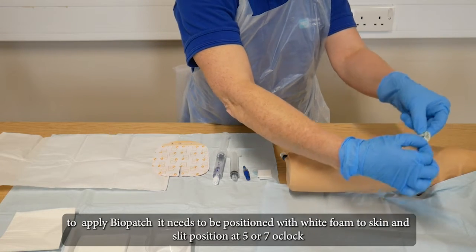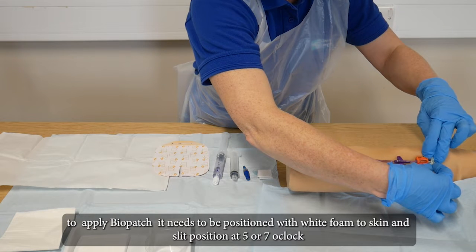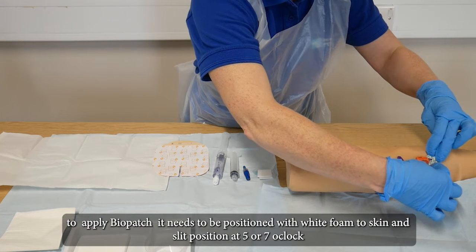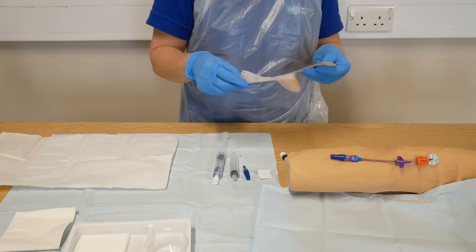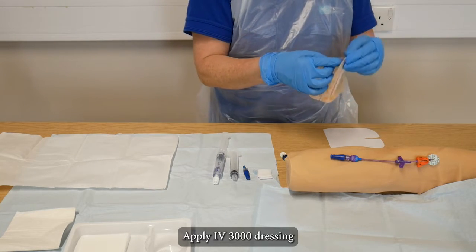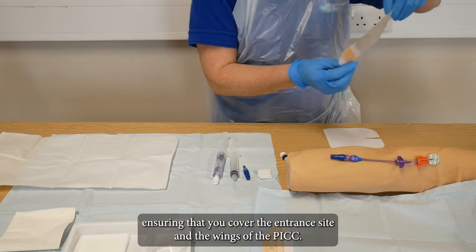To apply the biopatch, it needs to be positioned with white foam to skin and the slit positioned at 5 or 7 o'clock. Apply IV 3000 dressing ensuring that you cover the entrance site and the wings of the PICC.